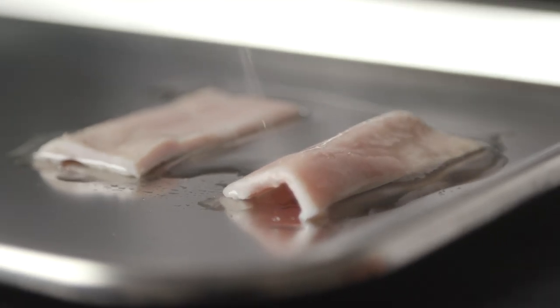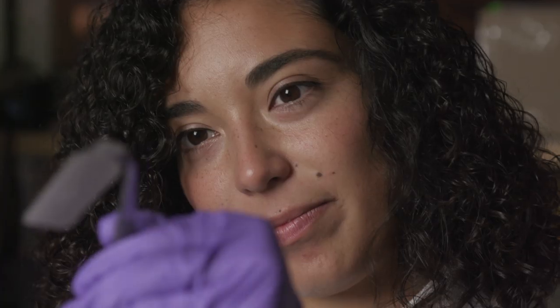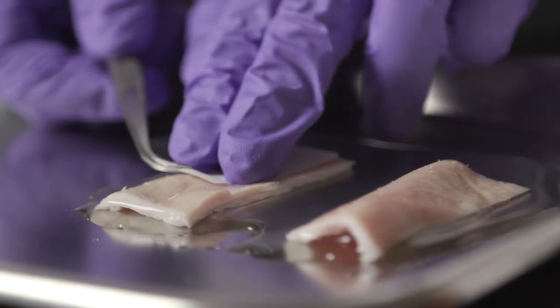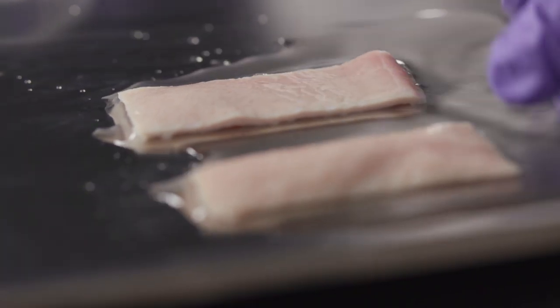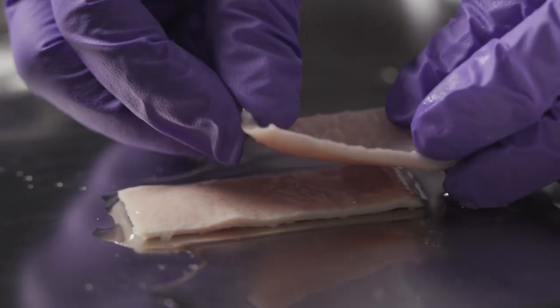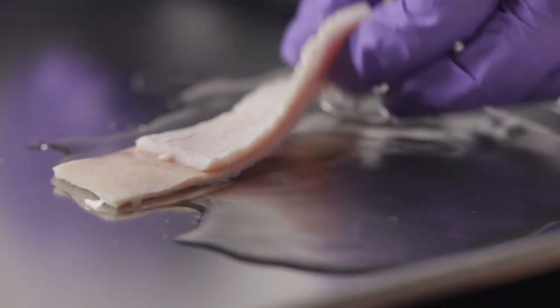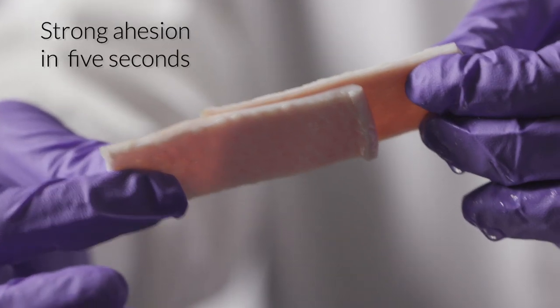Wet tissues are covered by a layer of surface water. Instead of improving existing bioadhesives, my lab invented a totally new bioadhesive tape to quickly absorb the surface water and then form fast reversible bonds and strong covalent bonds between the bioadhesive and the tissues, which give us very fast and strong adhesion.